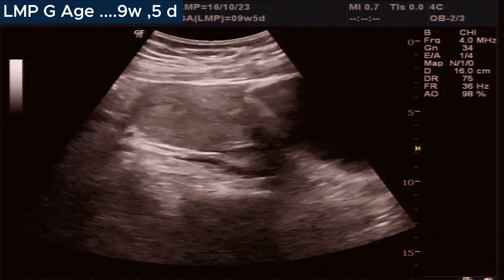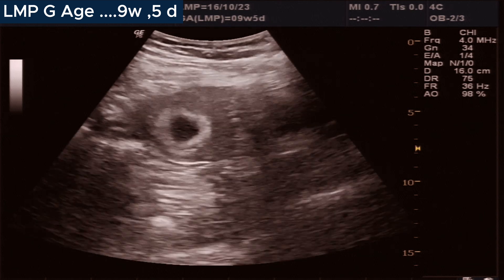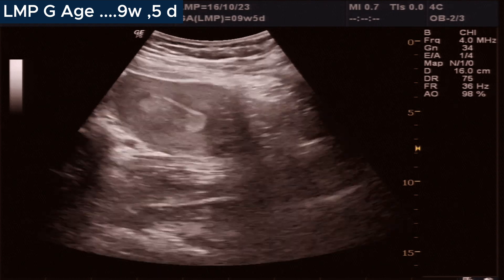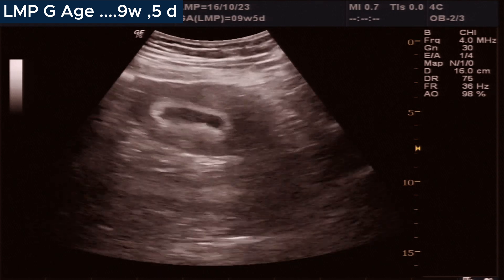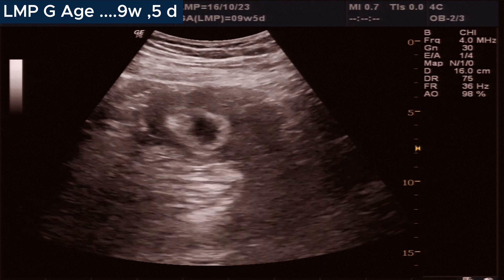In this video, the mother's gestational age according to LMP is 9 weeks and 5 days, which means her third month of pregnancy has started.